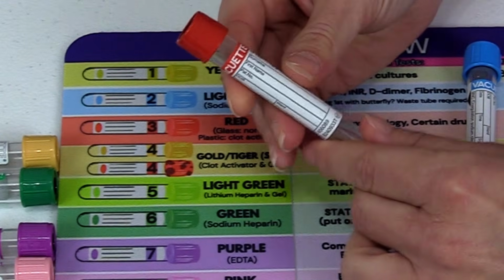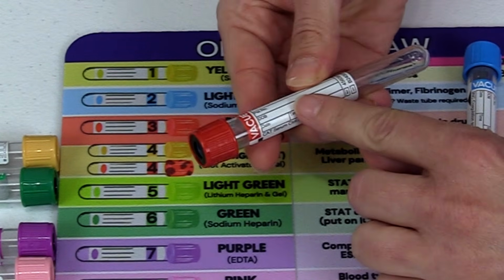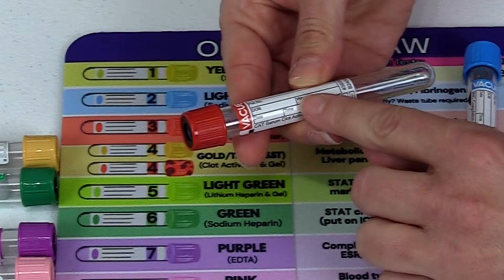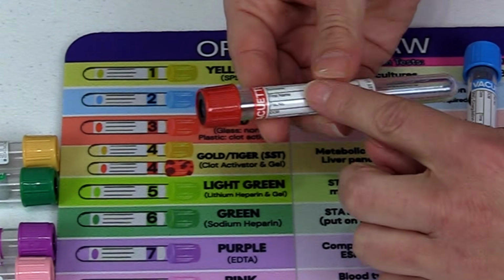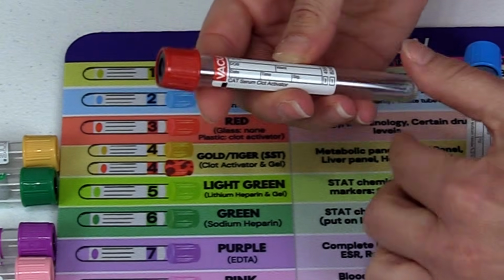In addition, you're going to have an area where you could fill out the patient information if you needed to. A lot of times today we have stickers that we put here, but maybe you work somewhere where you have to actually fill this part out.